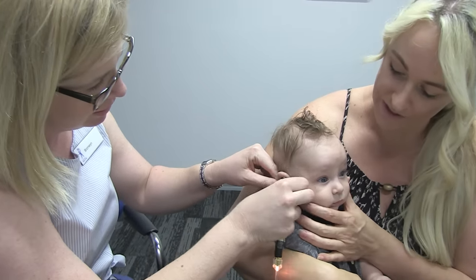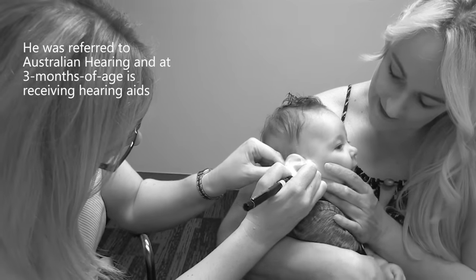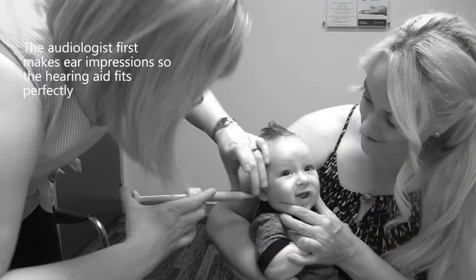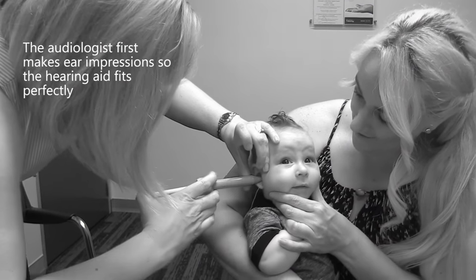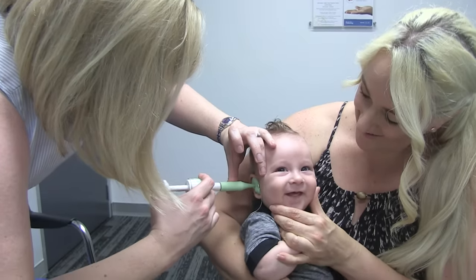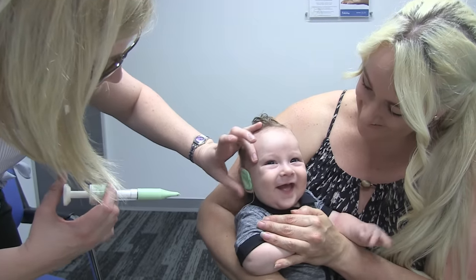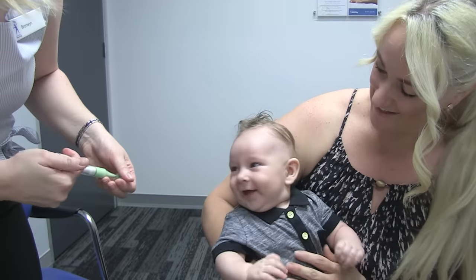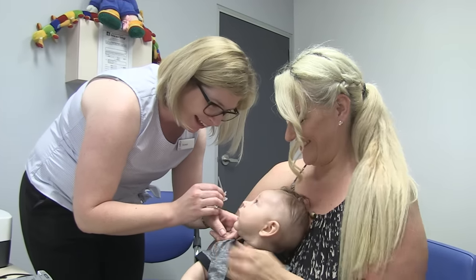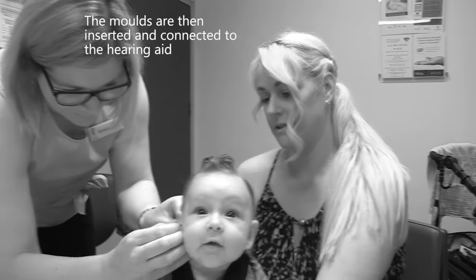Hold your head still — good boy, that's it, nice and steady. Here we go, good boy, well done. That'll take a couple of minutes to set and we'll pull it out. Okay, so what we're going to do is put the moulds in — good boy.